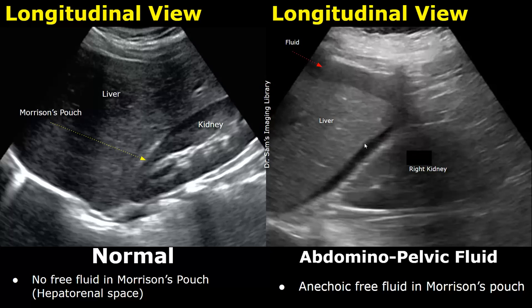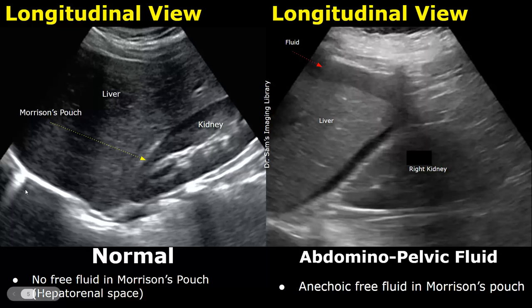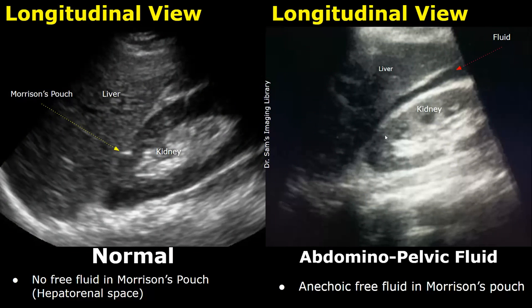We can see anechoic free fluid in Morrison's pouch. During this scan, we can also examine the subphrenic and pleural spaces to look for any free fluid in these areas. Here we have another image of abdominal pelvic fluid — we can see a significant amount of anechoic free fluid between the liver and right kidney.